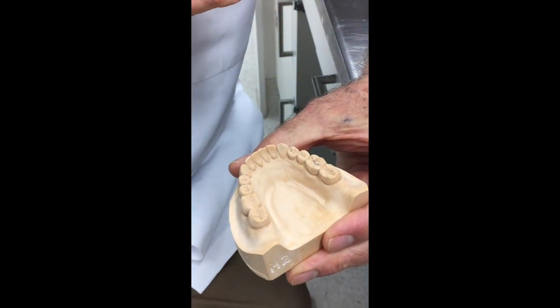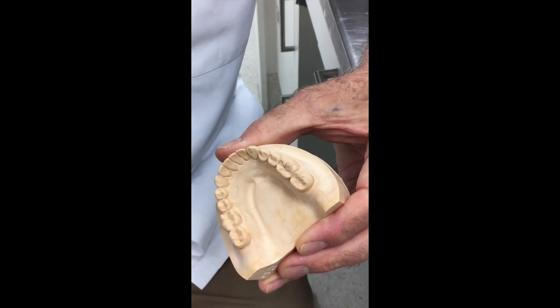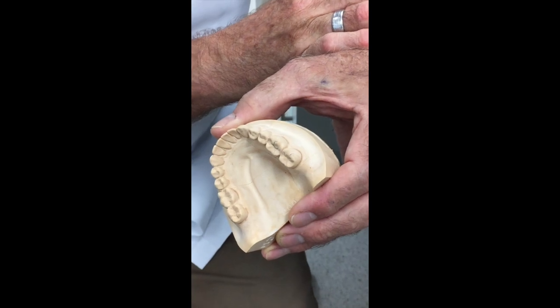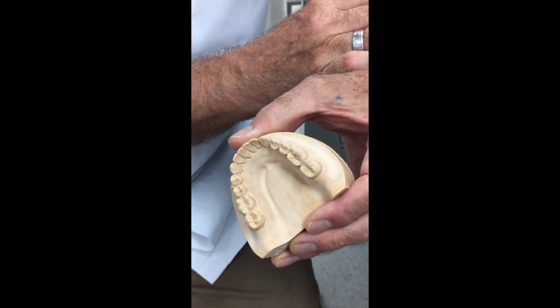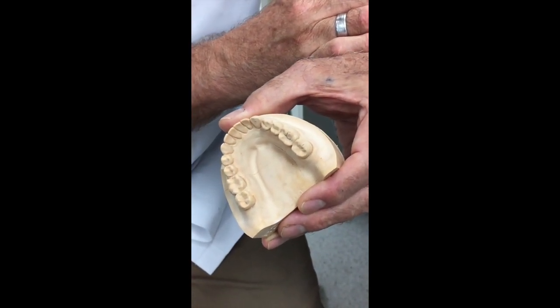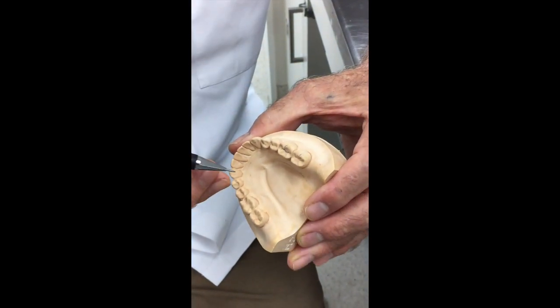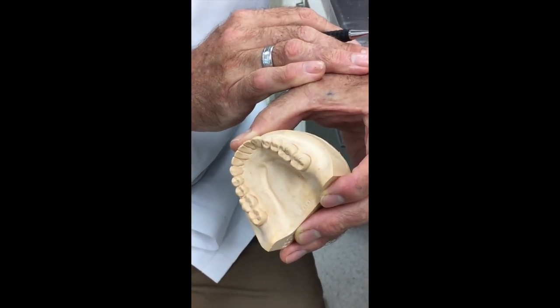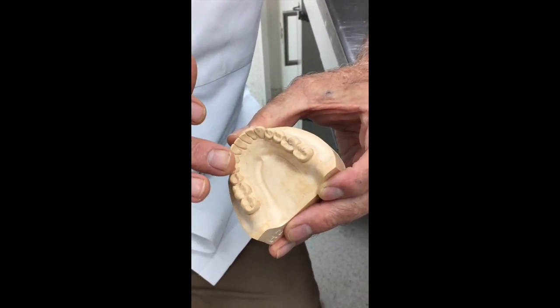And the first thing that we're going to do is to outline where our tray is going to go so that we can fabricate the border of the tray exactly to that outline. We don't need to have a large tray for crown and bridge. In fact, it's counterproductive both in the cost of material that might be used to take the impression and also in the cumbersomeness of the tray when we're getting to the end of that long appointment when the patient's had their mouth open and you're going to take a tray and place it in their mouth after you've done the retraction and so on.